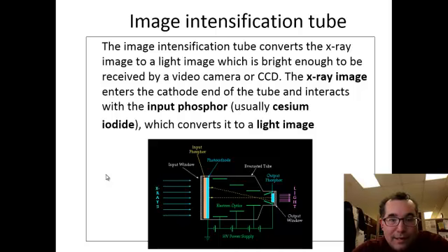And that light that comes out, as mentioned, can be captured or received by a video camera, and once upon a time that video could be recorded by, let's say, a VCR. But now more commonly in the digital environment, as we discussed last week in our CRDR lecture, we can capture that light with a CCD, a charged coupled device. Right? That charged coupled device will then be able to convert that light information into electrical signals and ultimately a digital image.